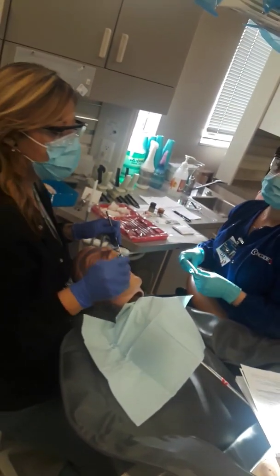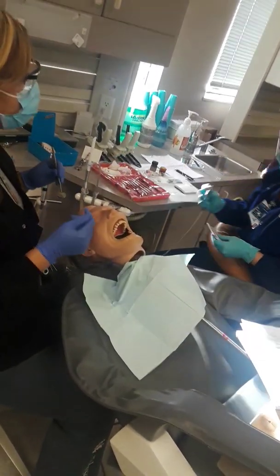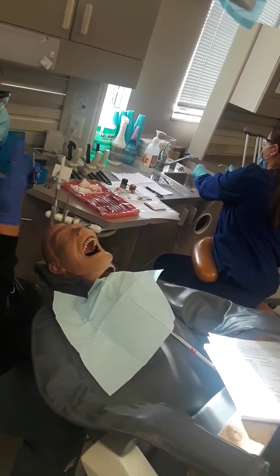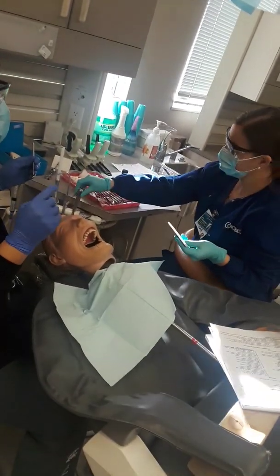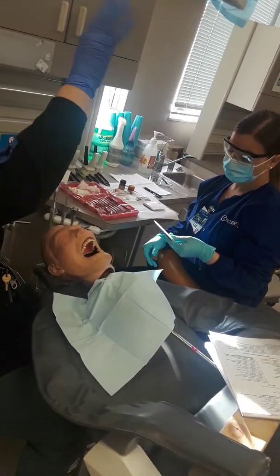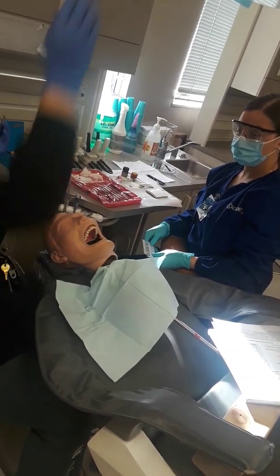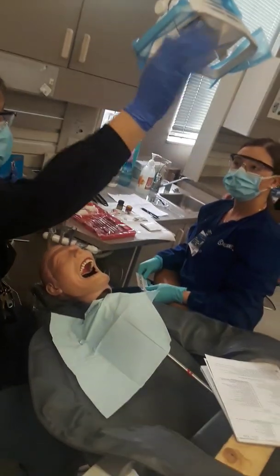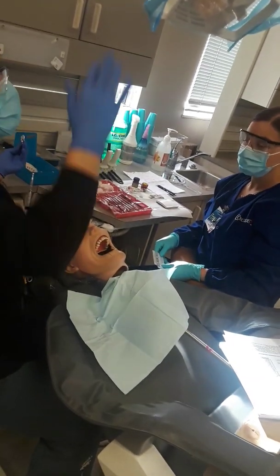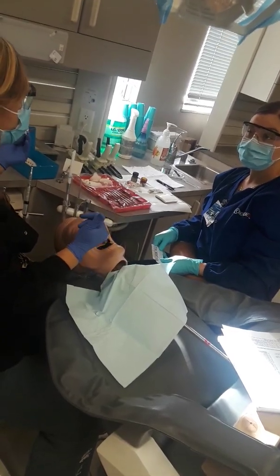Next, she turned off the light because it is better to have natural light when doing a shade. So if you could take your patient outside, especially if you're doing a front tooth, that's probably the best time. You'll get the shade because of the natural sun. If we leave this on, it's kind of like a yellow hue, so I have them turn off the light. Don't just move the light, which means the light's still on and you're just shining it a different way, because the hue is still going to come through. So always turn off the light. You'll get a better contrast of color when you do a shade, guys.